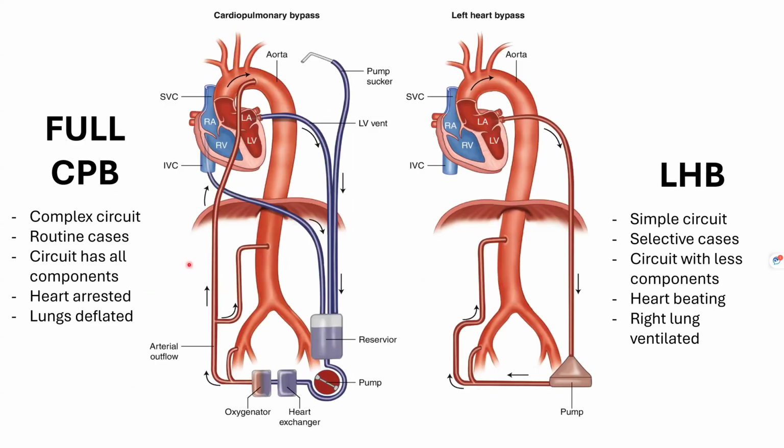So now we'll look into the differences between a full cardiopulmonary bypass and left heart bypass. I don't know how many places do left heart bypass because it's very selective to very selective sections of the aorta. At my site, we do it maybe a couple of times a year, but sometimes a year goes by where they don't even do it. So it's just for information. Don't get carried away with too much information here.